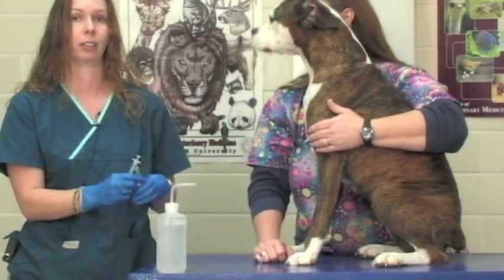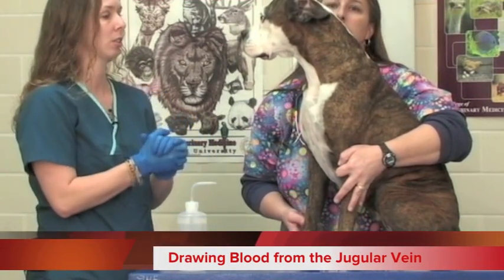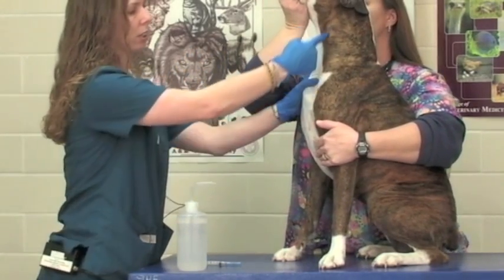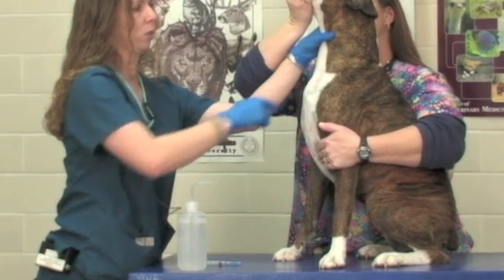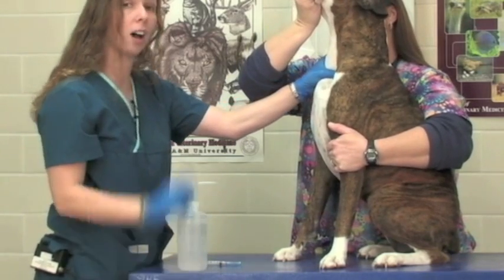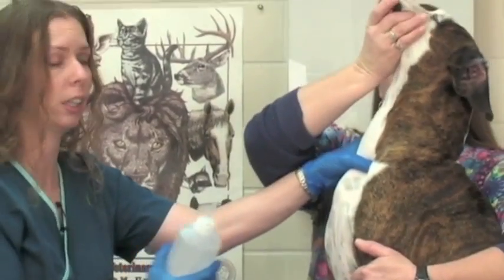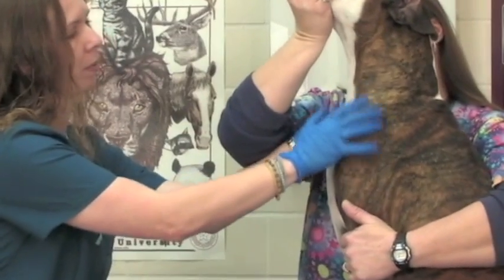That is the basic procedure for any blood draw from any vessel. The same would be true for a back leg — the only difference would be the manner in which we restrain our patient. Now we're going to demonstrate the procedure for drawing blood from a jugular vein. Your restrainer should gently lift the patient's head up. The jugular vein runs from here to the thoracic inlet on the chest. Place your thumb perpendicular to the vein and slide it down into the thoracic inlet, pushing in and up slightly, and the jugular vein will rise so you can palpate it. Use alcohol to lay down the fur for better visualization.